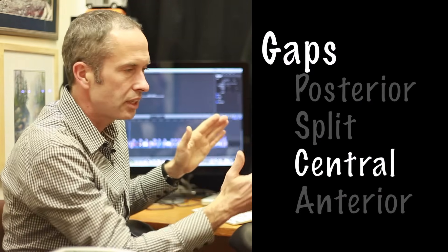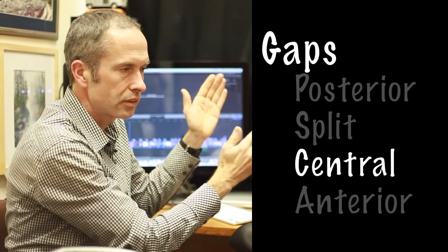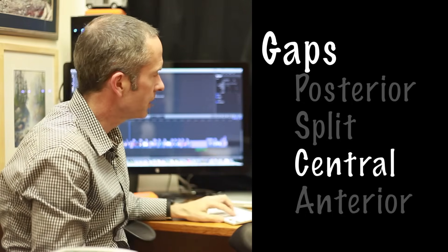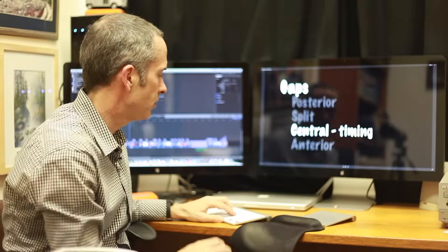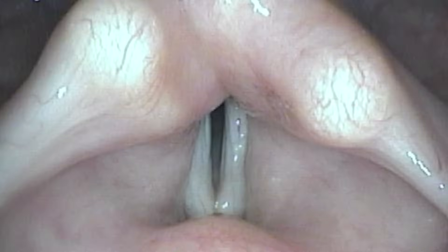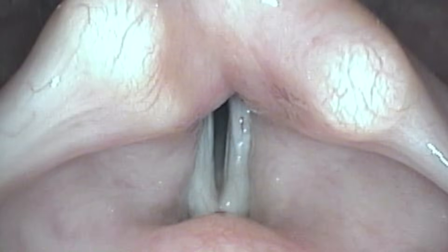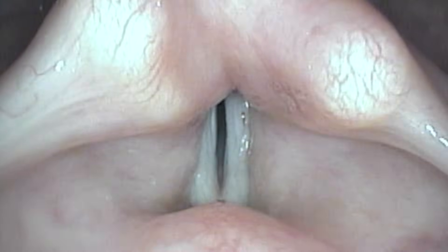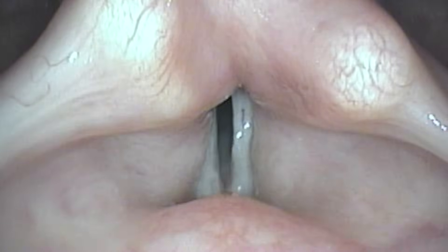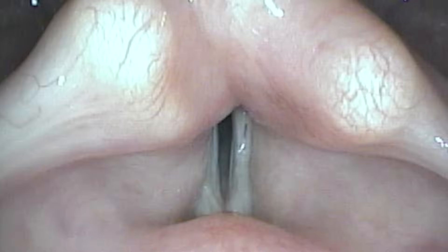We can also have a central gap that I'll call a timing issue. That's where the vocal cords may look like they're closing but they're actually oscillating so far out of phase that there's a continuous stream of air. So the vocal cords, even though they're overlapping each other, they never quite touch and air comes out continuously.